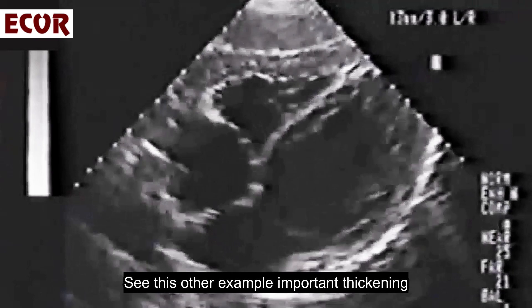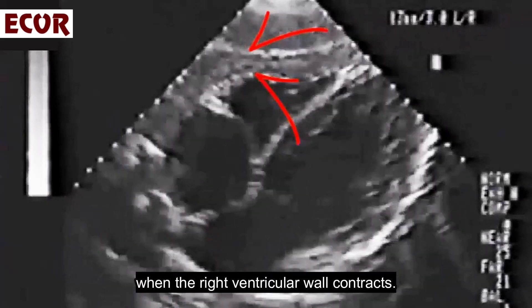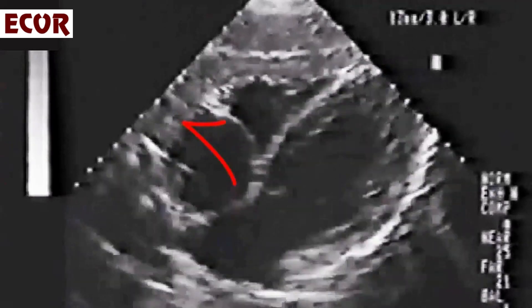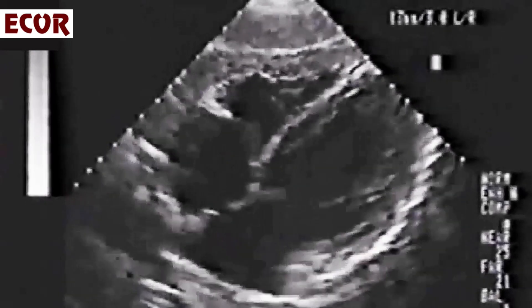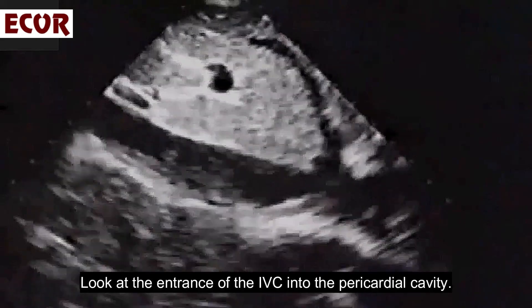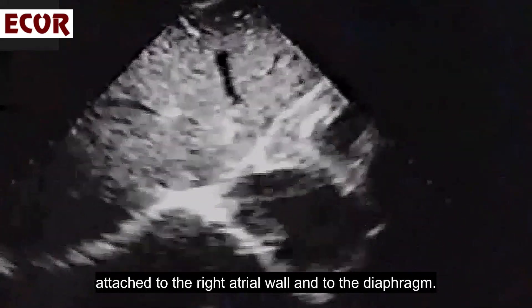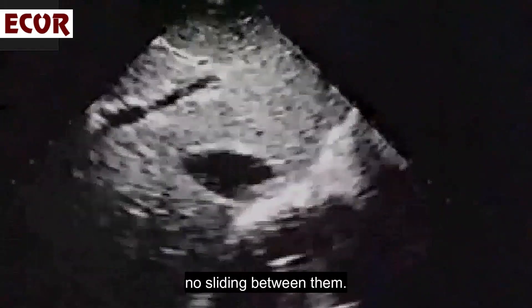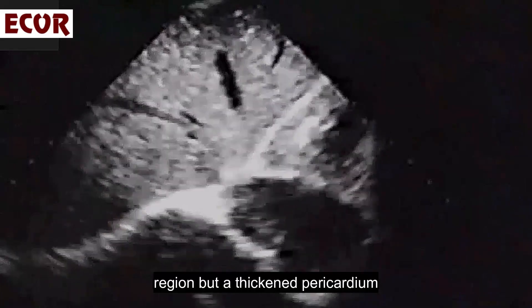See this other example: important thickening of the pericardium with pulling of the diaphragm when the right ventricular wall contracts. Notice also the pulling by the right atrial wall on the diaphragm. Look at the entrance of the IVC into the pericardial cavity, as the thickened pericardium is also attached to the right atrial wall and to the diaphragm. These structures move together with no sliding between them, and note there is no liquid in that region but a thickened pericardium.